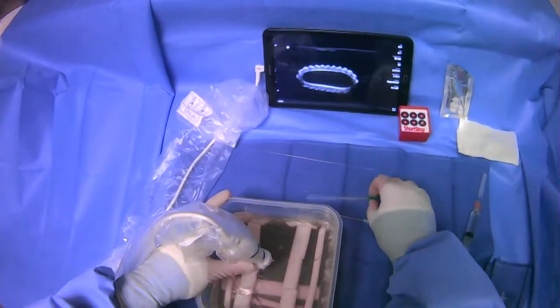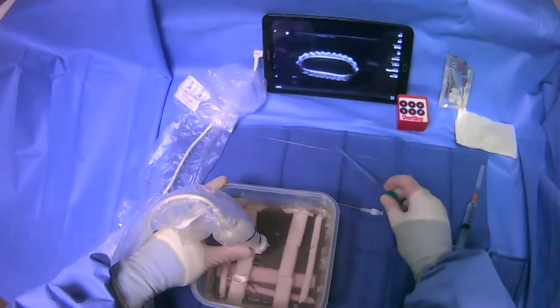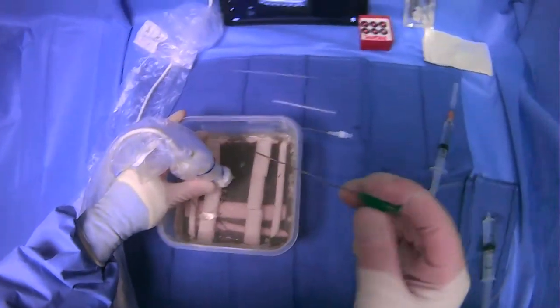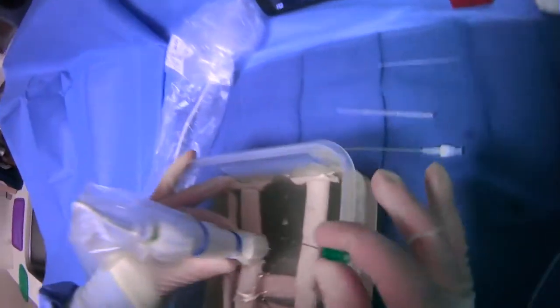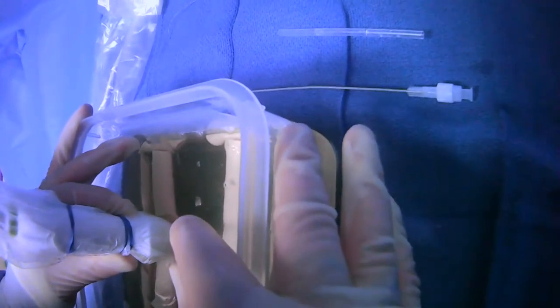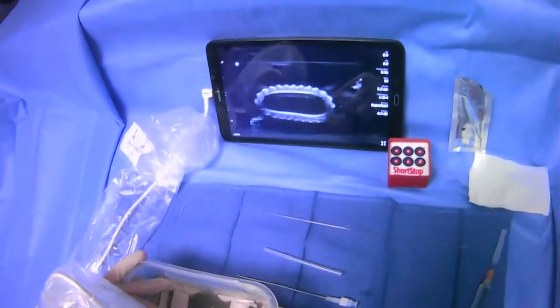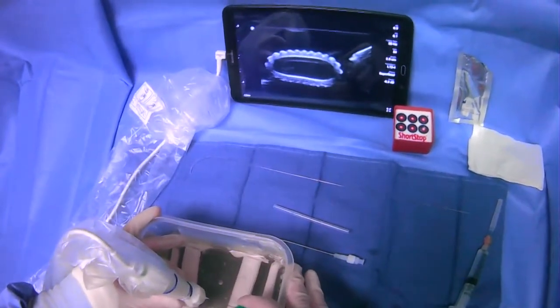Once you've picked your target and you're anesthetized, you will grab your micropuncture needle, and you just want to make sure that the bevel is up as you grab it. Then what we're going to do is keep our hands steady. We'll come from the side, going through the middle of the probe, and we can already see the vessel there on ultrasound.